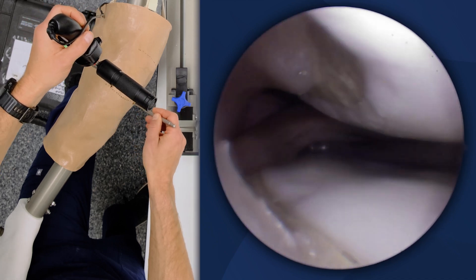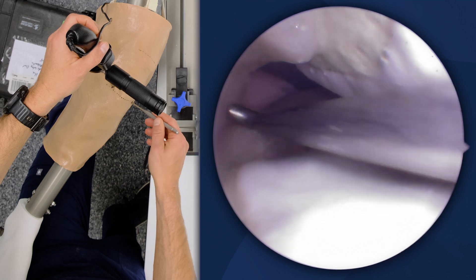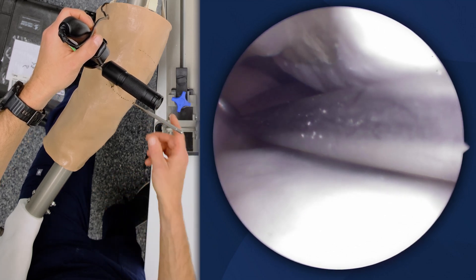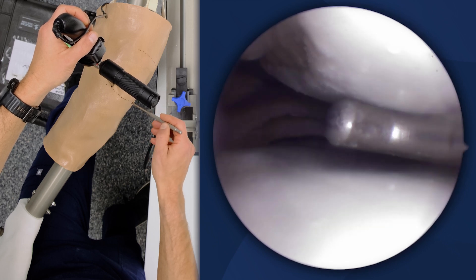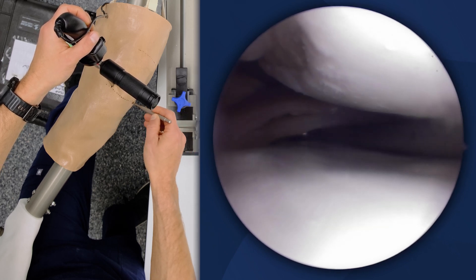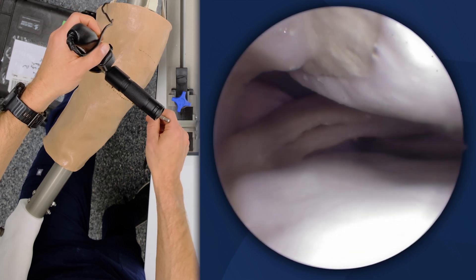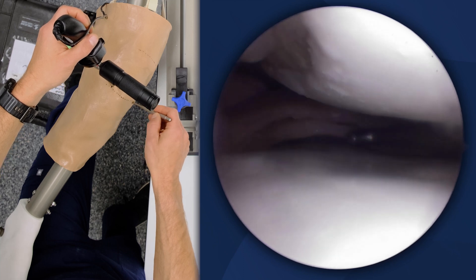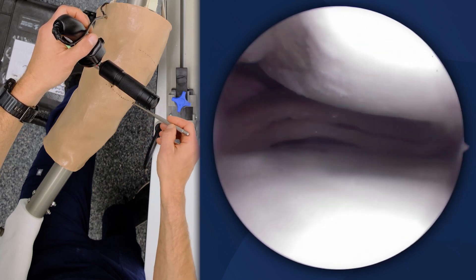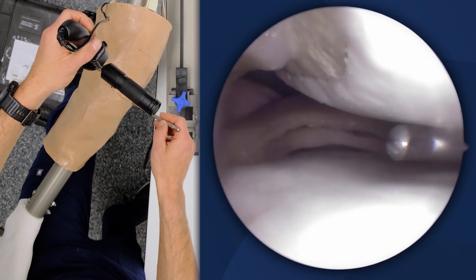We are unique in offering a simulation model that replicates this exact operative environment as I would have in the operating room, as cadavers do not provide this same positioning. Any surgical technique or skill that I'm going to practice on this medial compartment in a cadaver will not replicate what the environment will be when I translate that technique to the operating room.